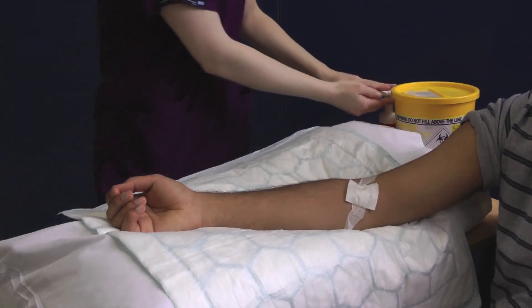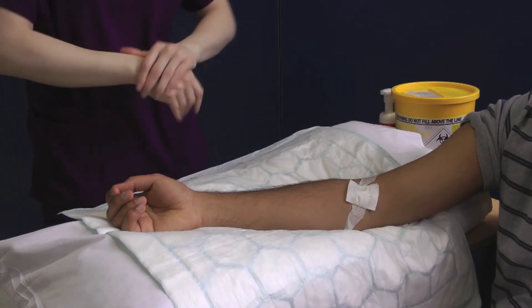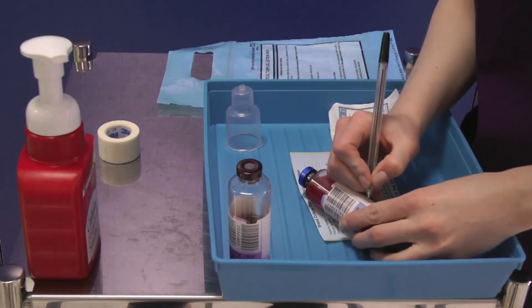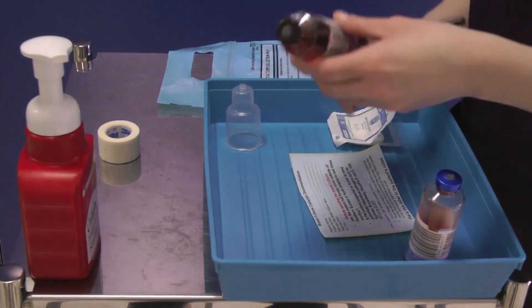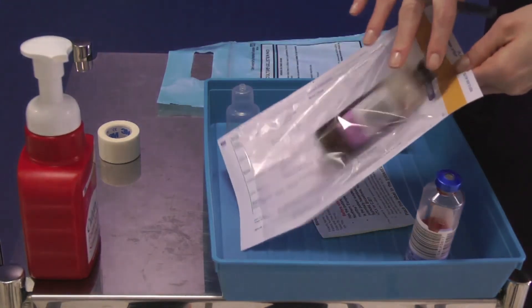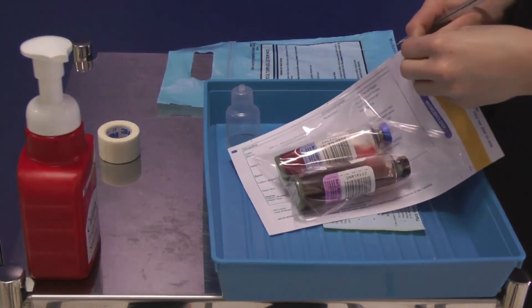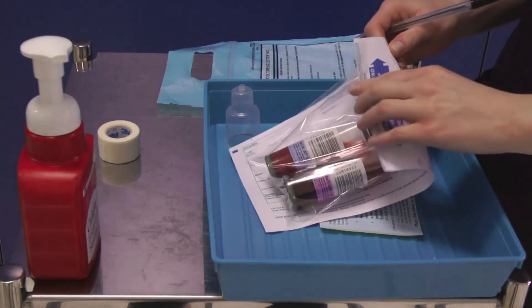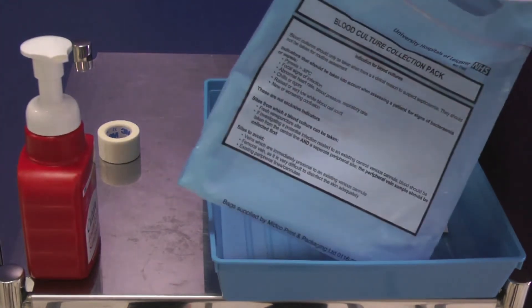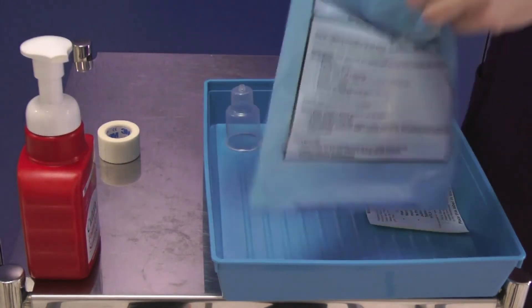Remove your gloves and apron, decontaminate your hands and turn your attention to the blood culture bottles. Label the bottles at the patient's bedside. Place them into the request form bag. Place this into the blue blood culture bag and seal it. A biohazard bag must be used for samples from high risk patients.